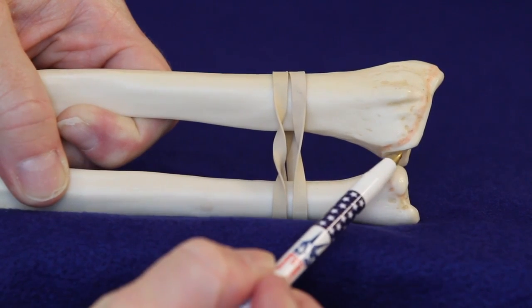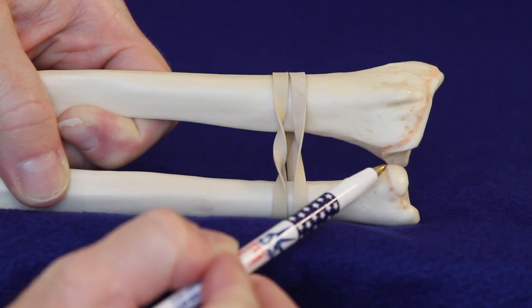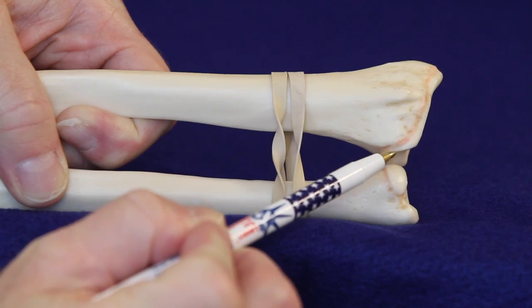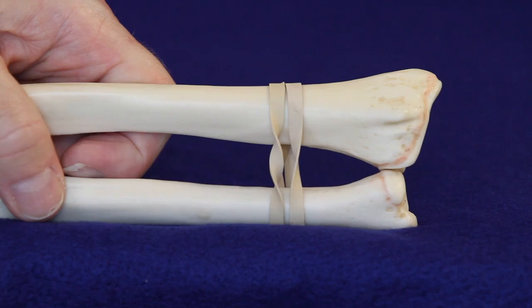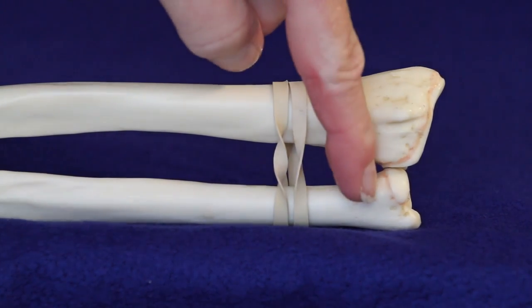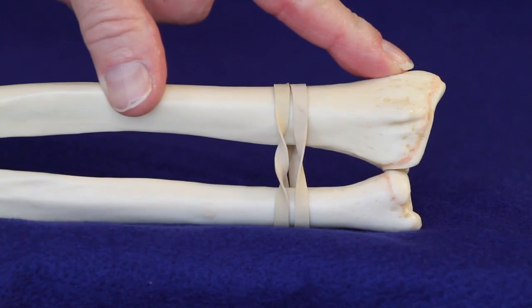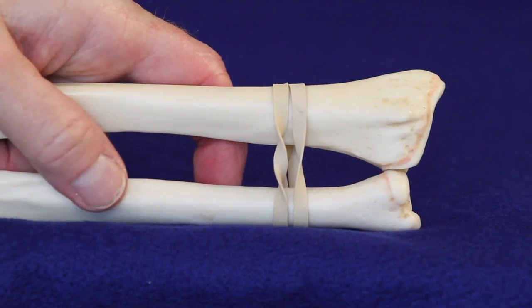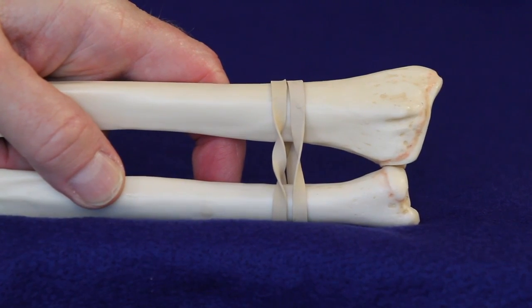Anatomically, the distal radio ulnar joint is composed of the sigmoid notch of the distal radius and the ulnar pole. The ulnar pole is fully covered with cartilage and the sigmoid notch rotates around the ulnar pole. During lifting, load across the radius loads the sigmoid notch and the ulnar pole. This creates an extreme amount of force in this area, causing it to wear out and become arthritic.